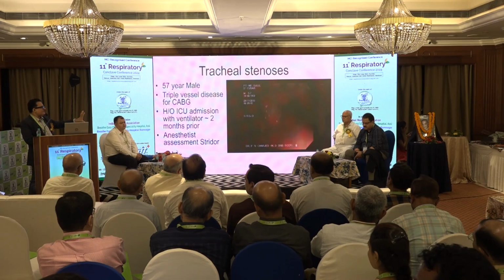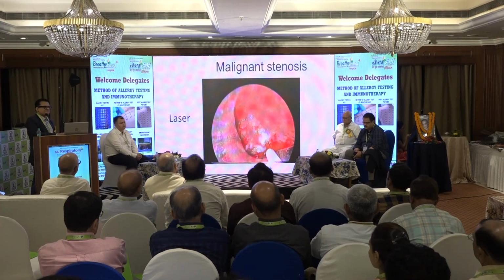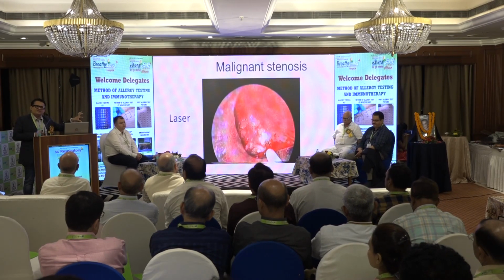Again, this procedure can be done in approximately 20 minutes, can be done in the endoscopy room, and we do this routinely. Look at this, that's a small stenosis, and you see this post-balloon tracheoplasty. I showed you a TB obstruction, I showed you a foreign body removal, I showed you a narrowing, I showed you a removal of a mass which eventually turned out to be TB.